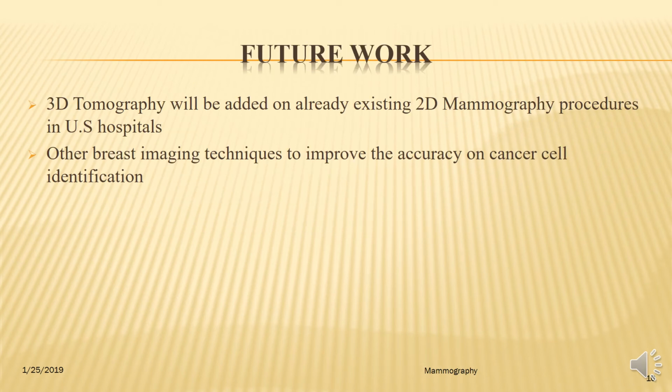In the future, 3D tomography will be added to already existing 2D mammography procedures and other breast imaging techniques to improve the accuracy of cancer cell identification.